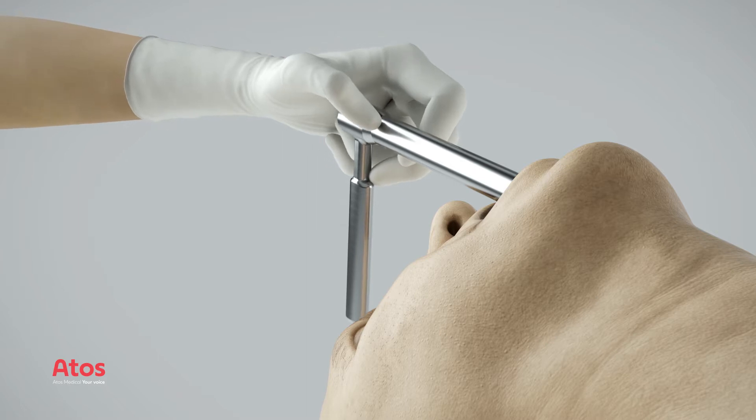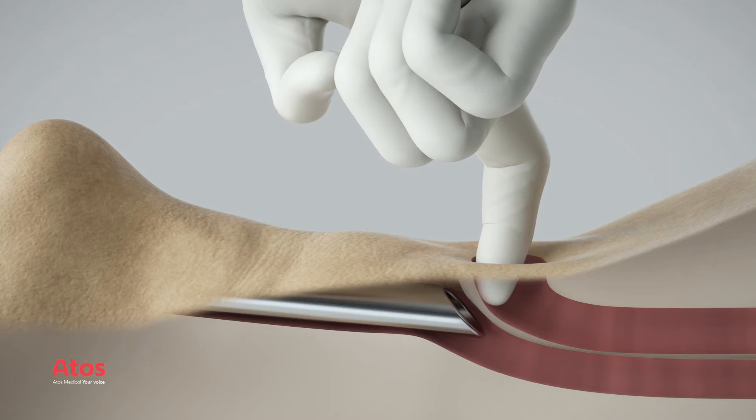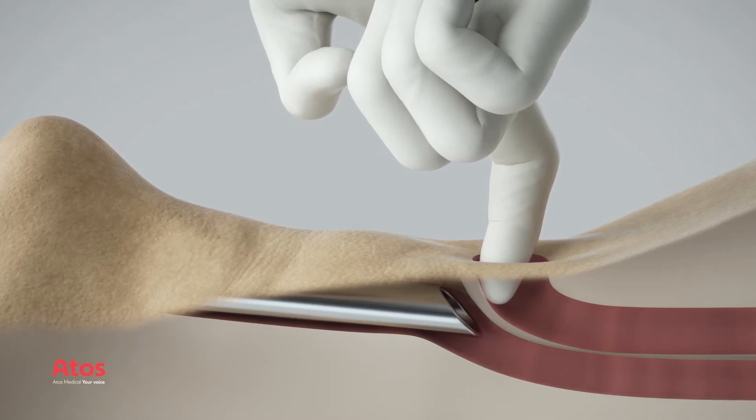Introduce the instrument into the esophagus. Verify the correct location of the instrument by palpating the trachea at the intended puncture site.